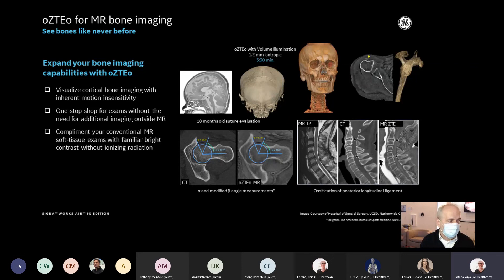Regarding Osteo, our application to see cortical bone, this uses a zero TE acquisition. Structures that have a really short T2 are now visible in MR, which we haven't been able to do in the past. It's really nice that you can have the soft tissue MRI examination perfectly synchronized with this scan — everything will be co-registered, giving you detailed information about tissues and structures that we previously couldn't image in cortical bone in such a way before.